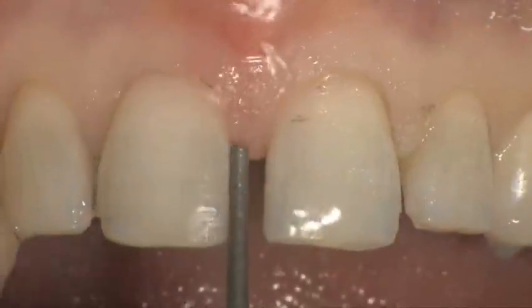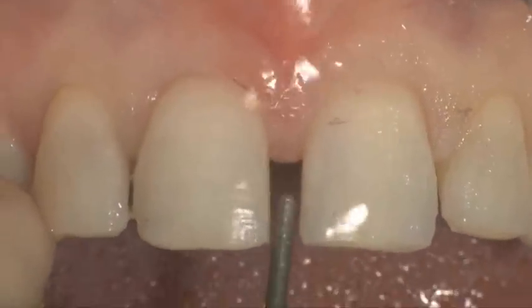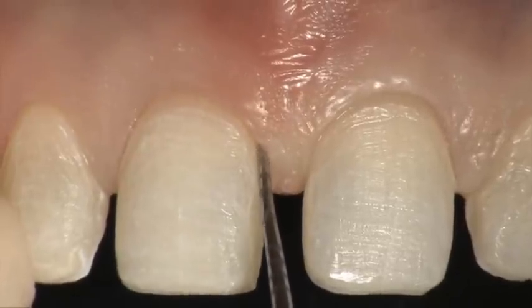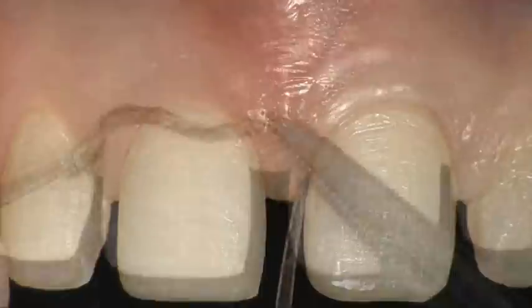The use of a double zero cord will displace the soft tissue, giving the opportunity to prepare a light shoulder, avoiding contact and consequently bleeding of the surrounding tissue.